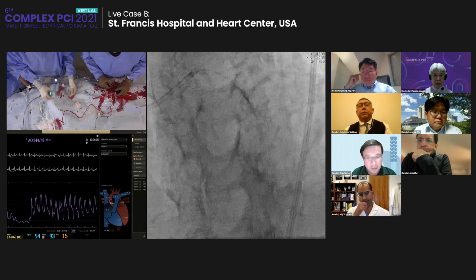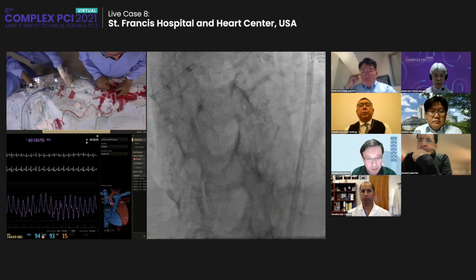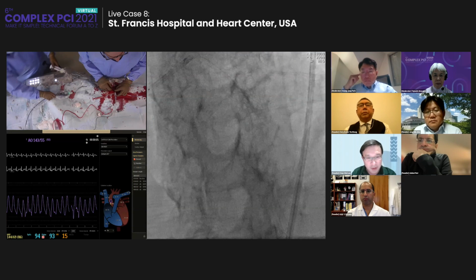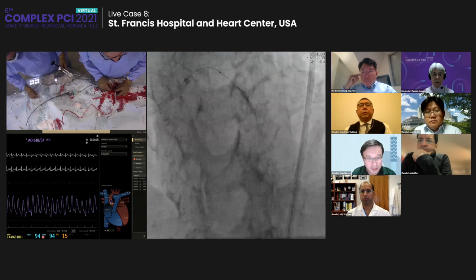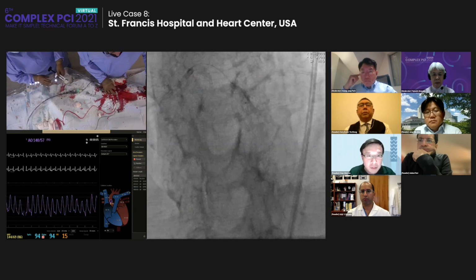So I'm going to ask them to give me my distal zone, and it's a 12 millimeter balloon with 2 markers, but the emitters are not spaced at both markers. One is 2 millimeters in and one is 4 millimeters in. So we're going to move that balloon to get our maximal effect.